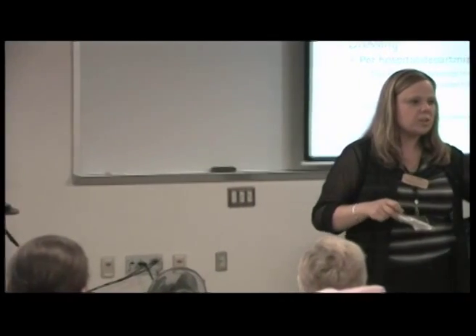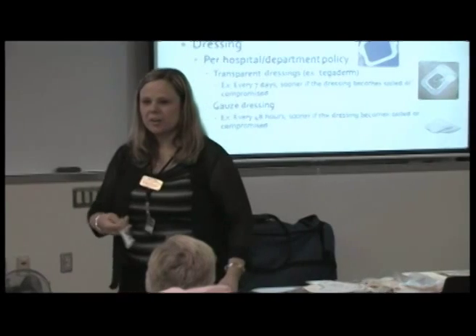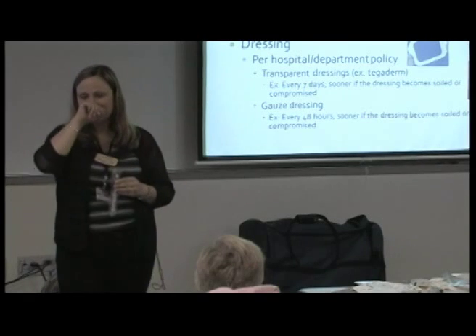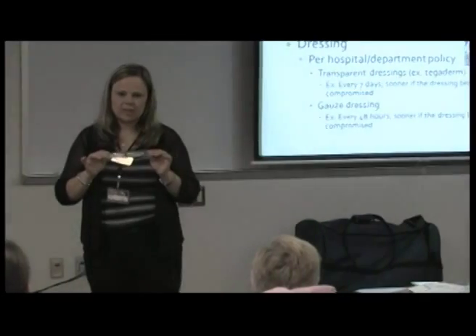So I'll pass these around. You guys obviously know what the saline flush is, but just so you can see what a heparin syringe looks like. If the patient says, oh, I have these for you, know that if your policy guideline is to flush with saline, you thank the patient or the hospital for giving us that equipment, but we should probably stick to the saline flushes.